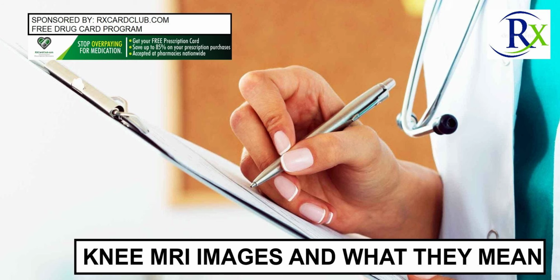The PCL, by contrast, is more easily seen on an MRI since it is about twice the size of the ACL. Isolated tears of the PCL are relatively uncommon. If one occurs, it will typically be seen as a distinct disruption of the ligament fibers.